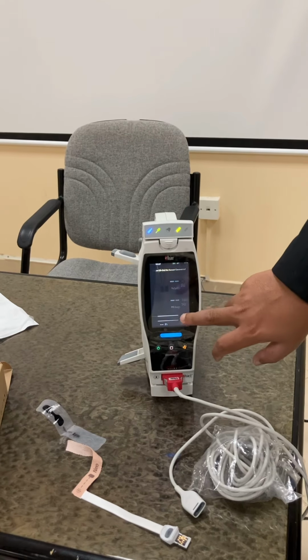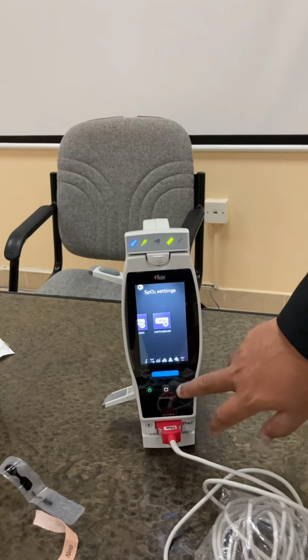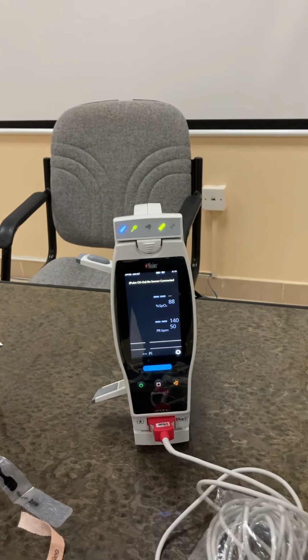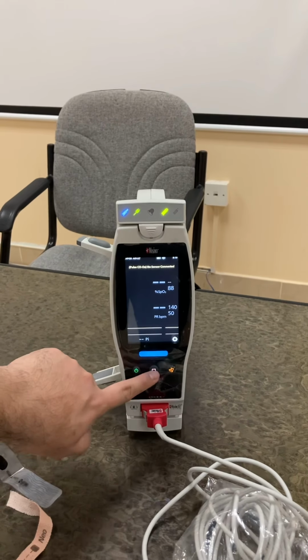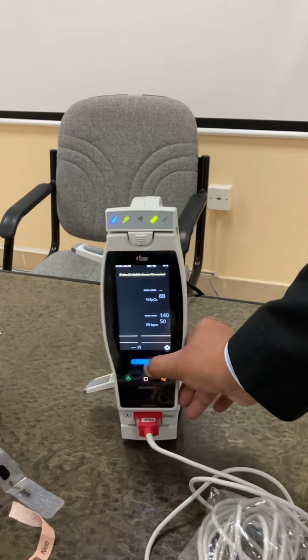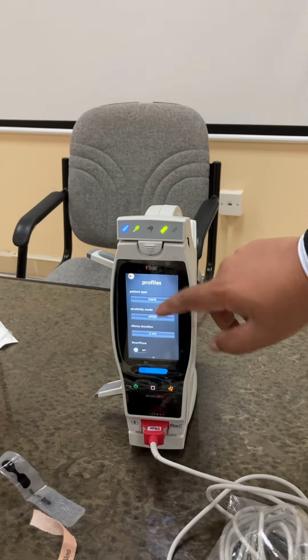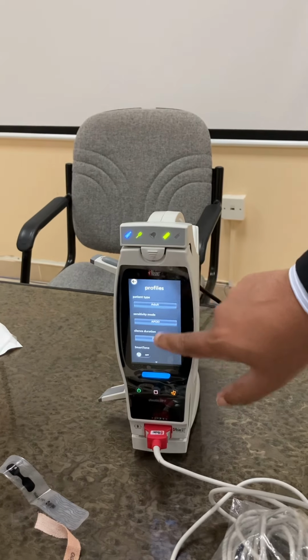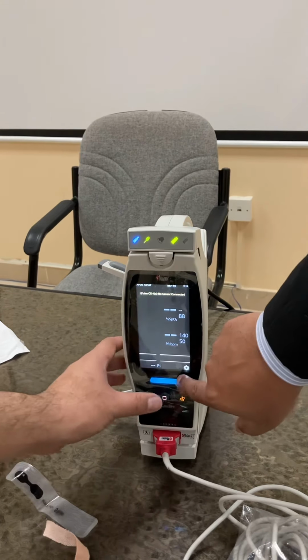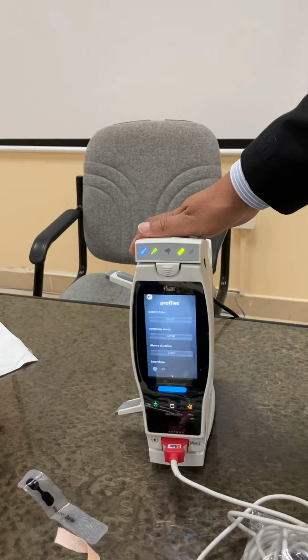Okay, you go here, you press here, and then you've seen it, and then you need to go back to the home screen. Just press on the home screen, so it will automatically go there. So this is good for the home screen. Yeah, the home screen. What is this for? This one? This is for the patient profile. Once you press here, you don't need to go there. It will be difficult to always press here, right? Yeah. So I can just press here. Press here, yeah, so that you can select the patient profile. That is better and easy. Yeah.